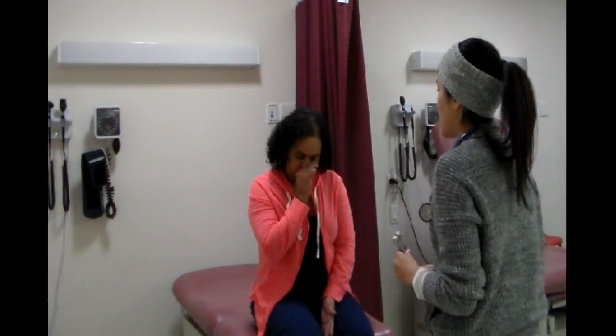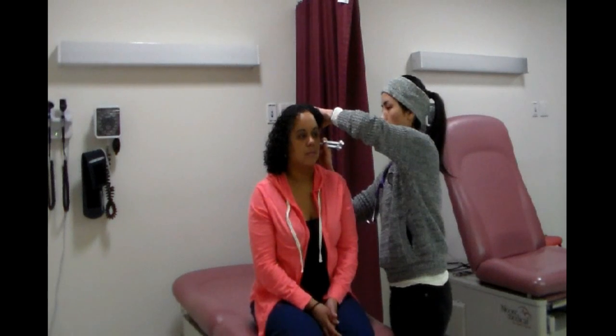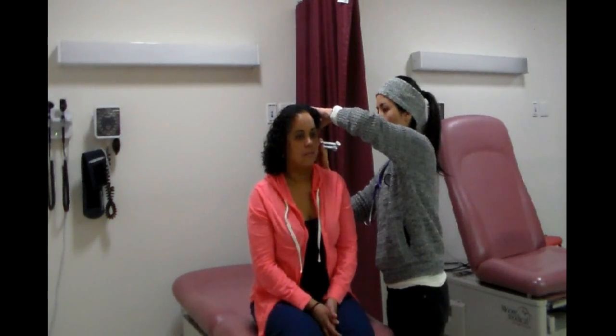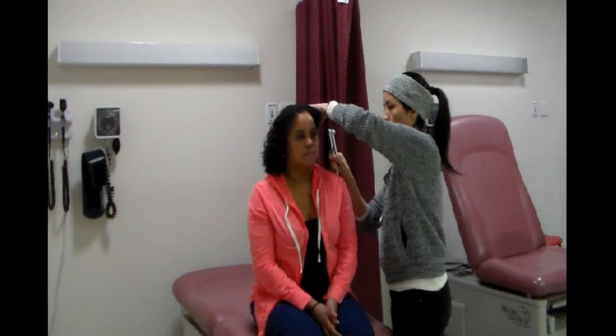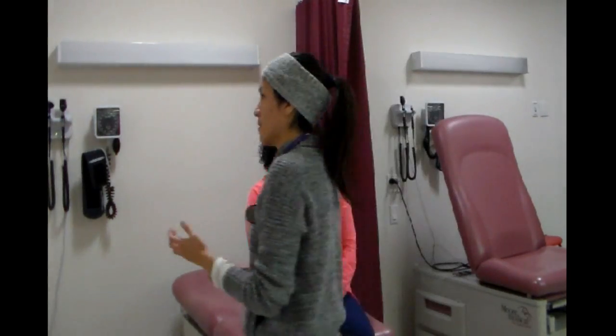Okay, good. That was the Weber test. The next thing I'm gonna do is the Rinne test. I'm gonna put it on the mastoid bone, and you're going to tell me when it stops. Then I'm gonna put it right next to your ear, and you're gonna tell me if you can still hear it. Tell me when it stops. Stop. Okay, good. So it means that air conduction is more than bone conduction.